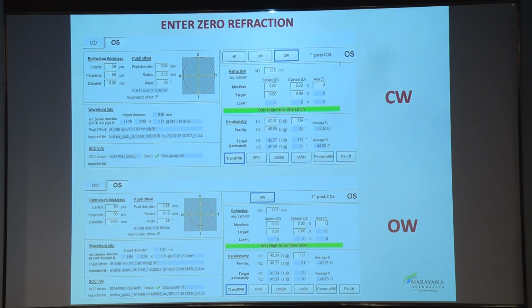But machines like that are slowly becoming rare. For example, Alcon is coming out with the Pentacam-like device. It's called Sightmap. It's nothing but a Pentacam, but it uses the ray tracing principle. So in the next generation of machines, you can buy it early. But this is already there in it. That's why I wanted to use this, because the names are different. It's like paracetamol, Crocin, Dolo, all exactly the same thing. But many times people get confused by names.